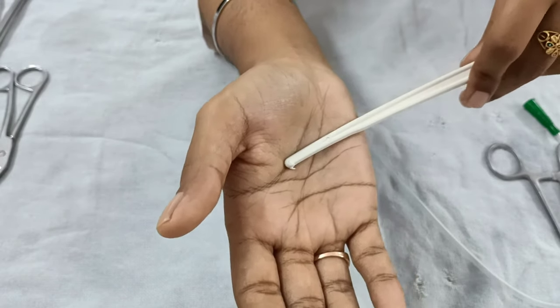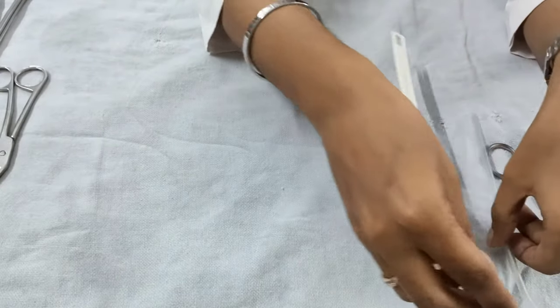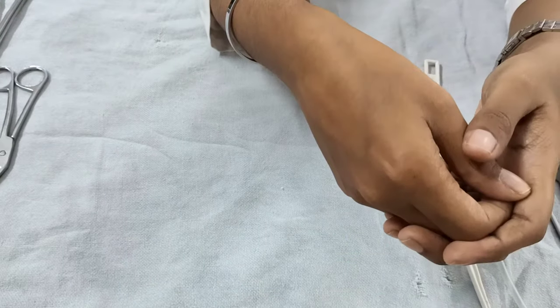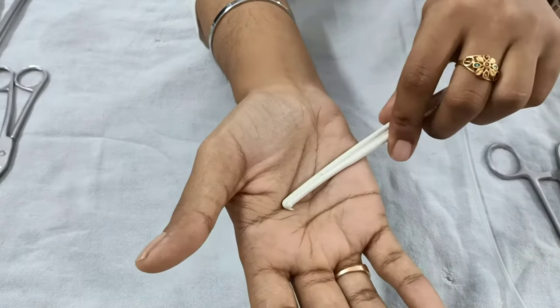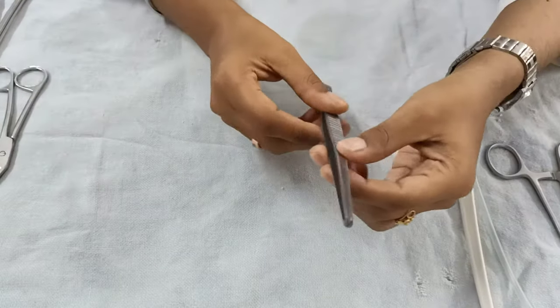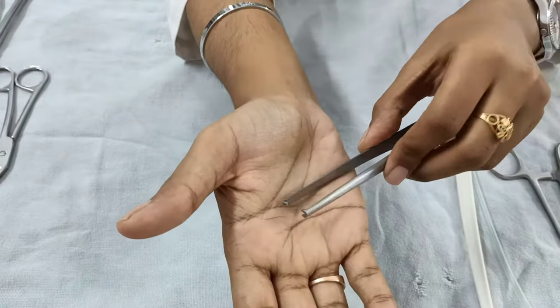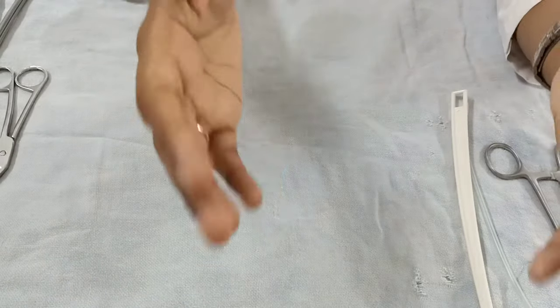Even after full dilatation of the cervix, if membranes have not been ruptured, you can use this amnio hook, or alternatively a Kocher's forceps or a tooth forceps to rupture the membranes.